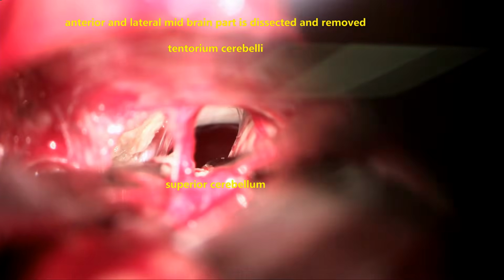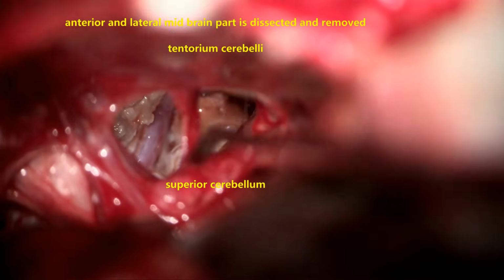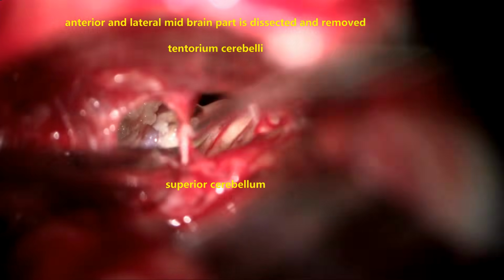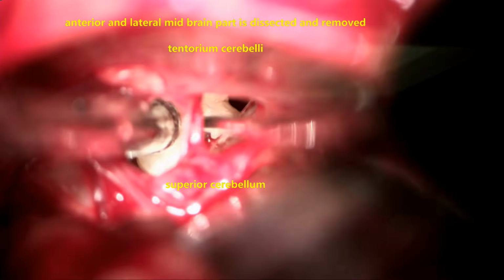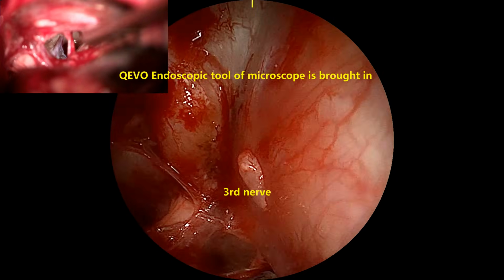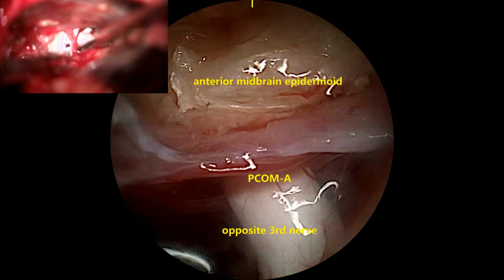At this juncture, we need to keep a watch on the 4th nerve and 3rd nerve, which travel here. Either they could be engulfed or encased by the epidermoid, or they may be shifted. We need to always keep looking for these cranial nerves to prevent postoperative visual deficits. Now you can see that in the space, the lesion is taken out completely. Due to the microscopic visualization restrictions, the endoscope is of great help in this.